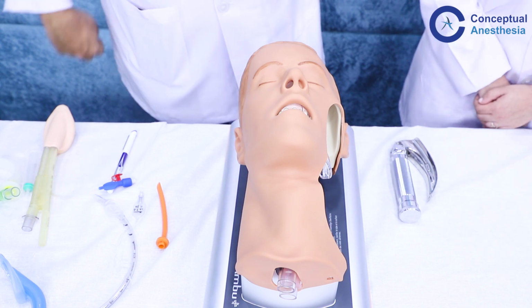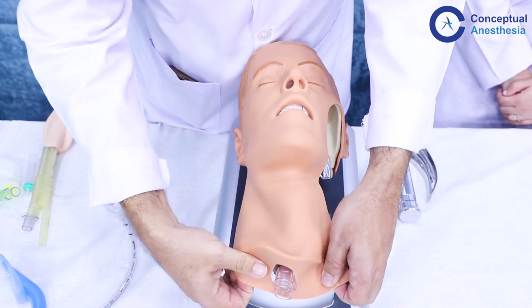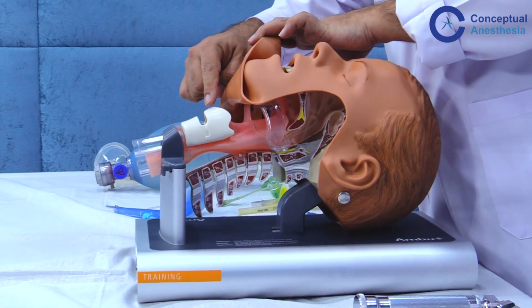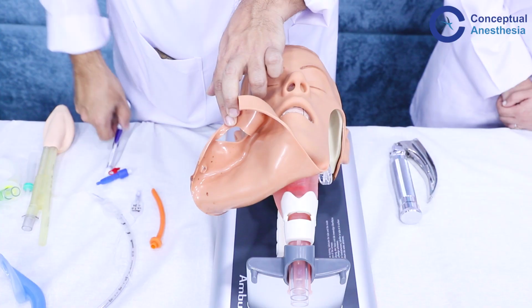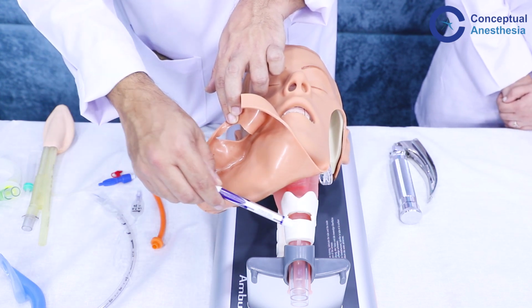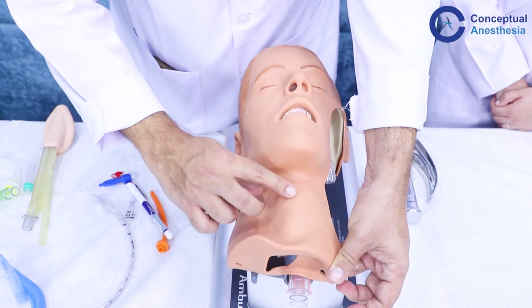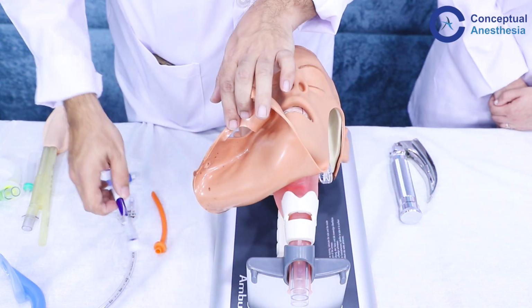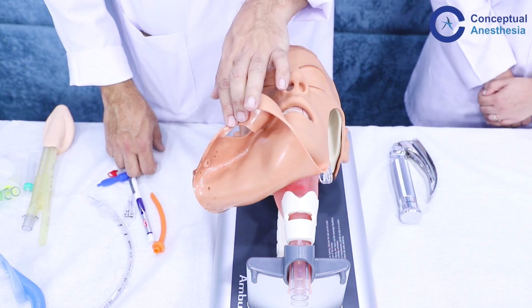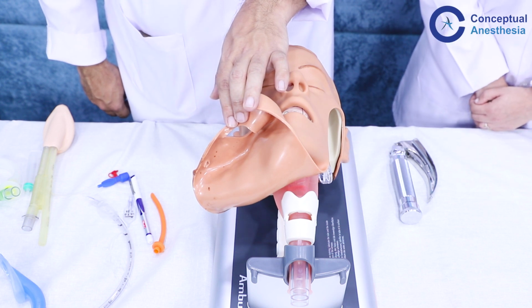First, we will show how to palpate for the landmarks. So, the most prominent part in the front of the neck is the thyroid cartilage. So, as you can see over here, the thyroid cartilage, and you can feel the front. And then we have the cricoid cartilage, which is a ring shaped cartilage below it. So, we palpate for both the thyroid and cricoid cartilage, and in between them there is a depression that you can feel. This depression is covered by a membrane which is called the cricothyroid membrane, and this is through which we can access the emergency airway in a patient.